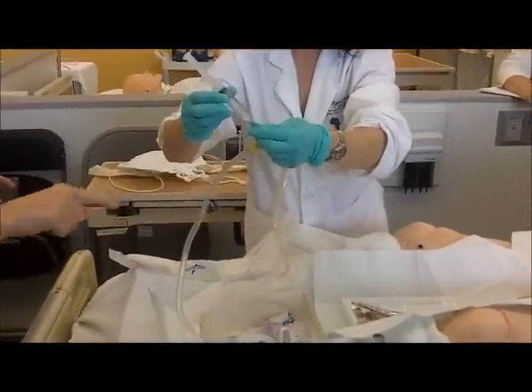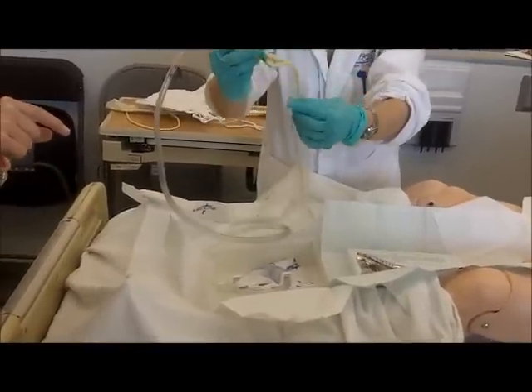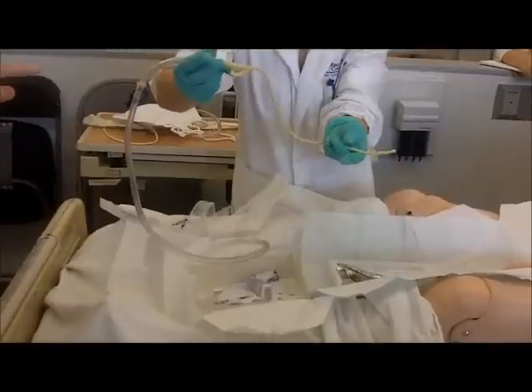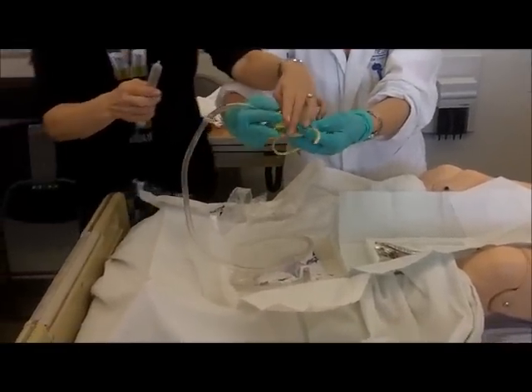Now you need to take off this plastic. You have to take the plastic off. That's dangerous. Okay, let's stop right there. This is normally what I do. Let me show you what I normally do.